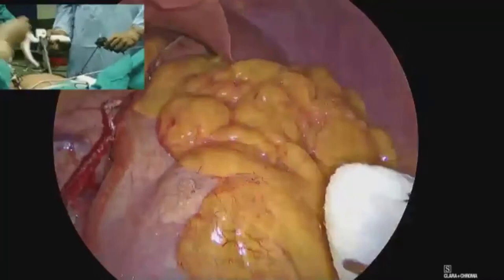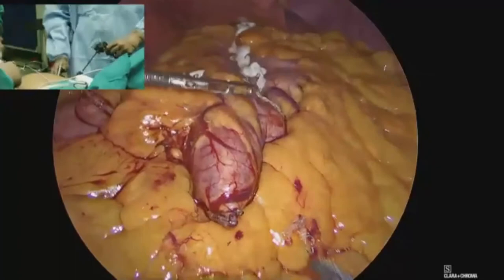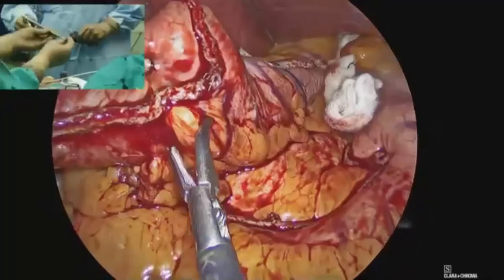I can put a gauze there. Most of this bleeding is going to stop by the end of the procedure. We just put a gauze there. The patient is light, so the blood pressure is a little high. We have already requested our anesthetist to put him back to sleep. That can often happen. Now, this is the posterior part of the stomach.